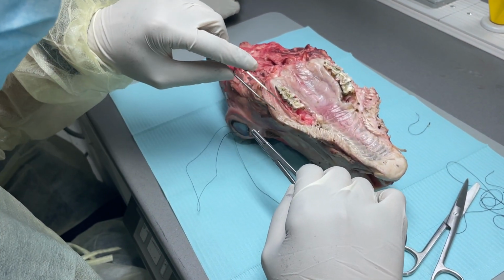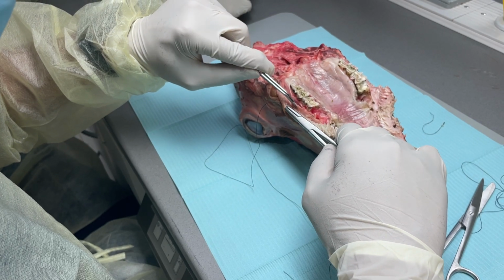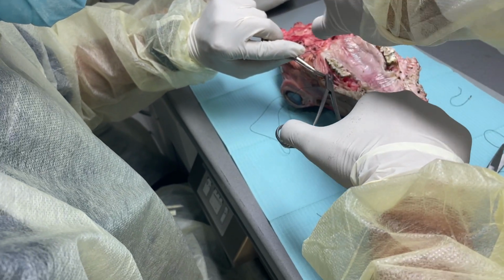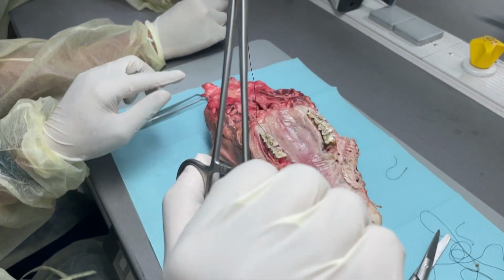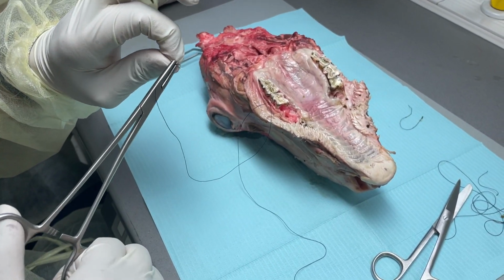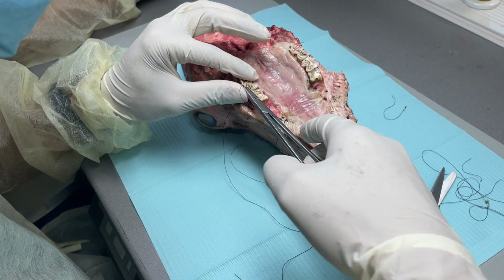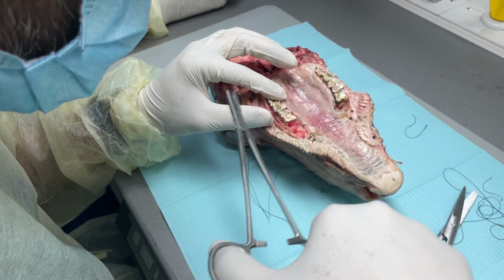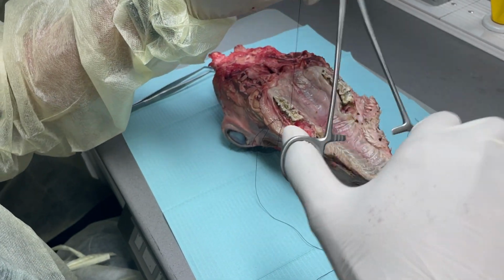Doctor, how many types of figure of 8 do we have? One is in the extraction socket, one is in the interdental, when the tooth is there. In the extraction socket, we go in and then also. I will show you that. Now again, same step. From the buccal, external, I came. Now I will go to the lingual. I came to the lingual.